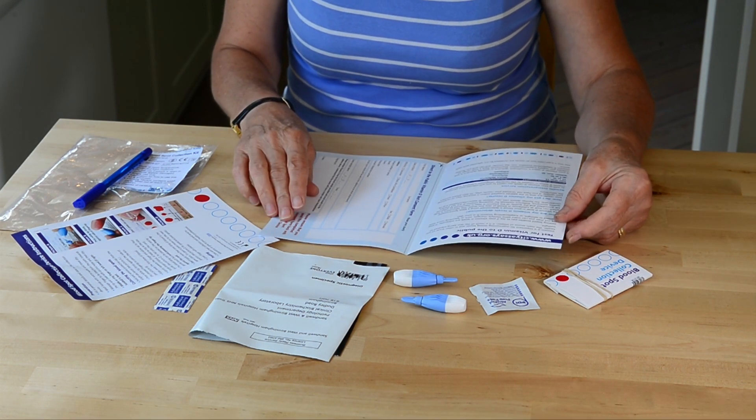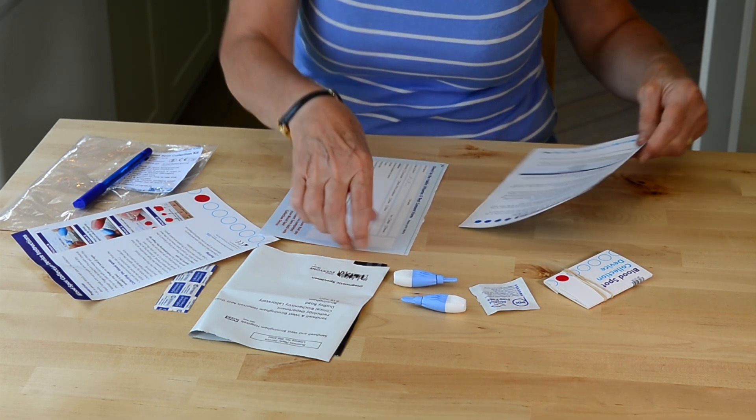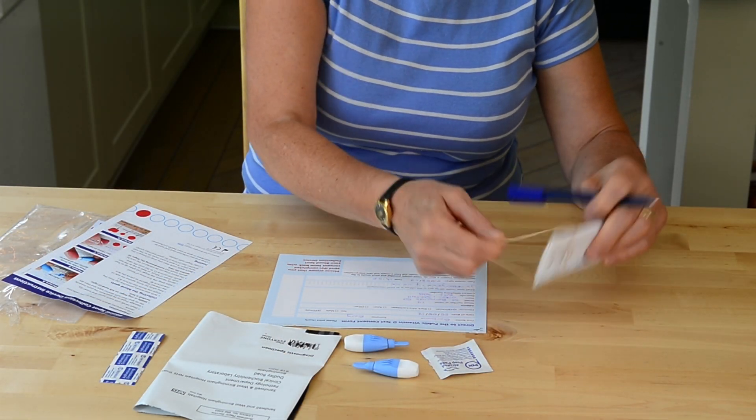Once you've read the instructions you need to tear off the consent form and fill in all your personal details on the form as well as the blood spot device. Also complete your details on the device.